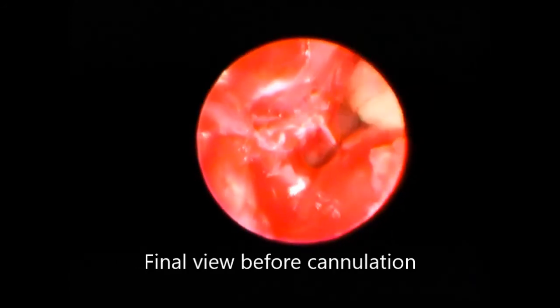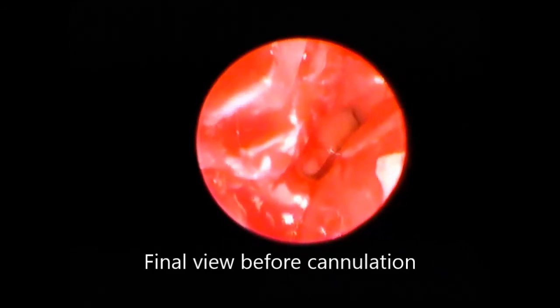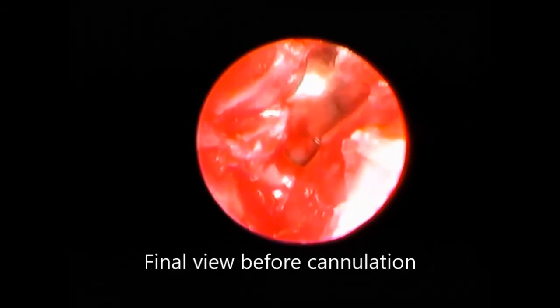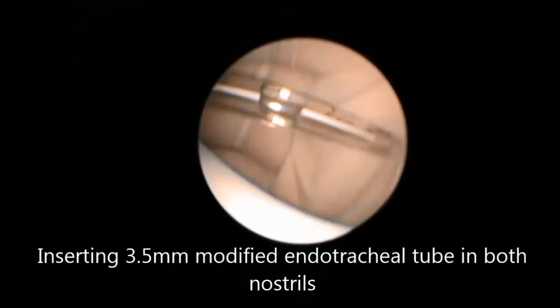Final view before we applied the stent — it was a 3.5 millimeter endotracheal tube which was trimmed to size and placed in both nostrils, into the choana, bypassing the choana but not touching the posterior nasopharyngeal wall. You can see the soft palate below.